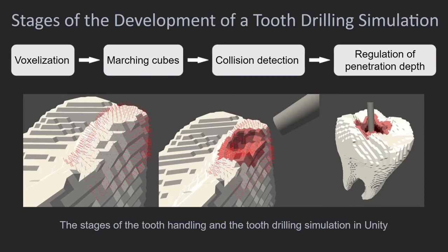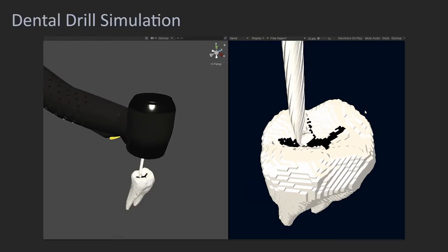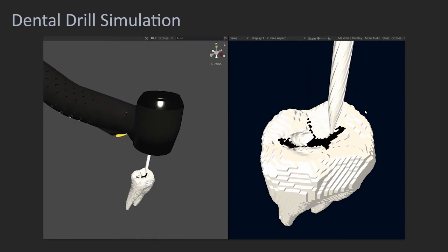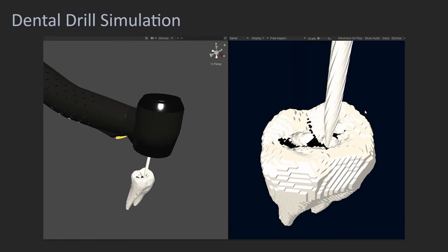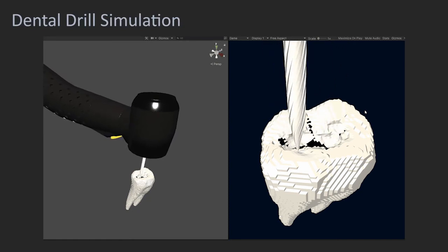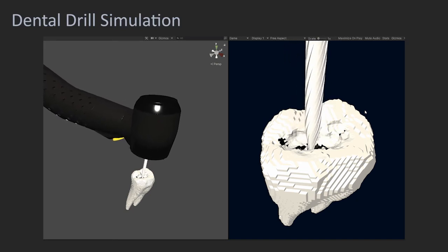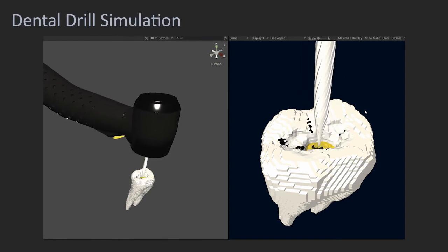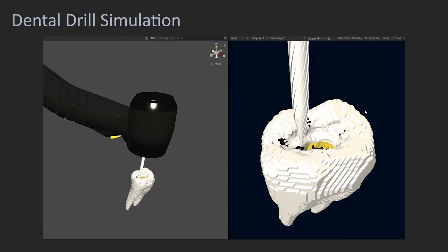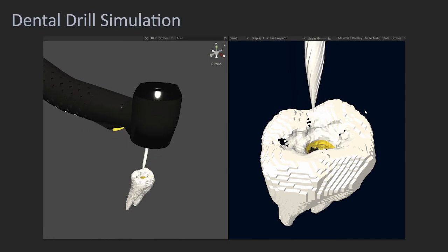The approaches to the detection of penetration depth of the dental drill have an important role to simulate tooth drilling. We consider different approaches, such as the approach based on the sum of resistance forces at all boundary boxes of the drill, moving velocity, and material removing velocity. The next approach is based on the proportional dependence of the reaction force and penetration depth of the dental drill and proposed force filtering methods for possibility of large magnitude control of the force. The final approach is based on the evaluation of the penetration force by integrating the unit force acting on the outer voxel of the tool.